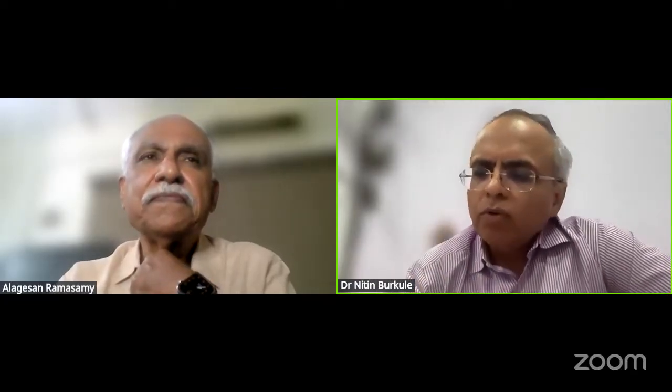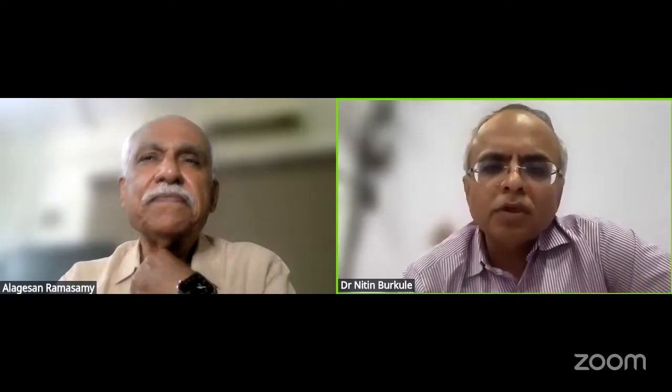Yeah. So I think the question is more oriented on the echo. What are the high risk prognostic features that they want us to enumerate? The diagnosis is similar to that. You have to be sure about the diastolic dysfunction first, and then if there is left atrial dilatation, pulmonary hypertension, etc., then it almost clinches the diagnosis of heart failure with preserved ejection fraction.